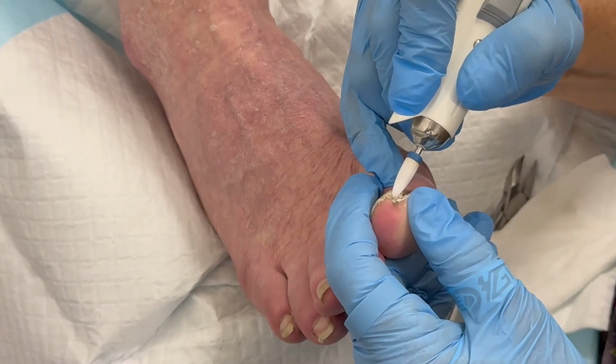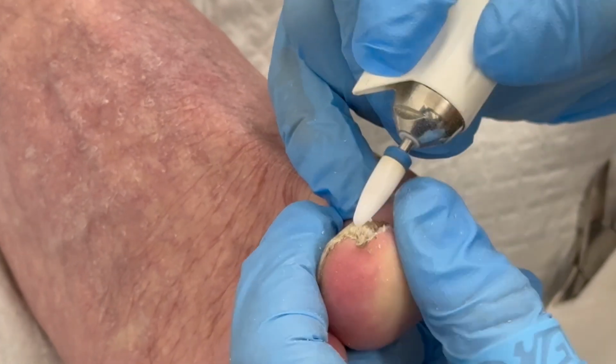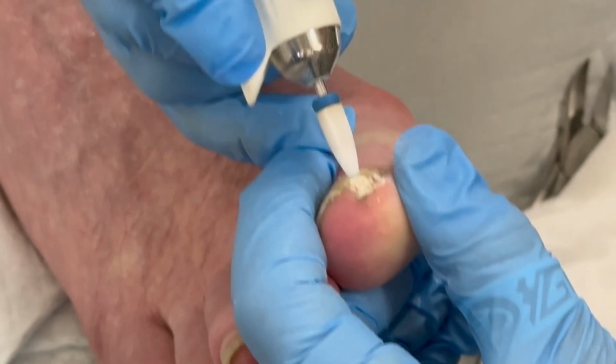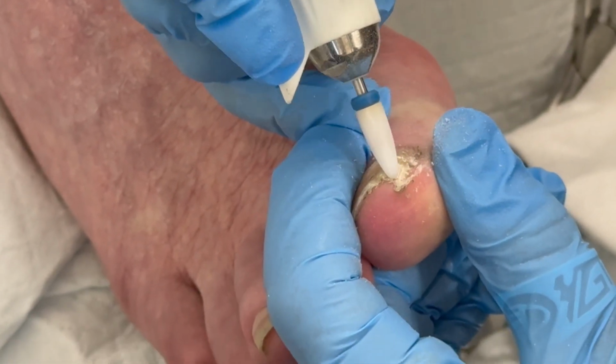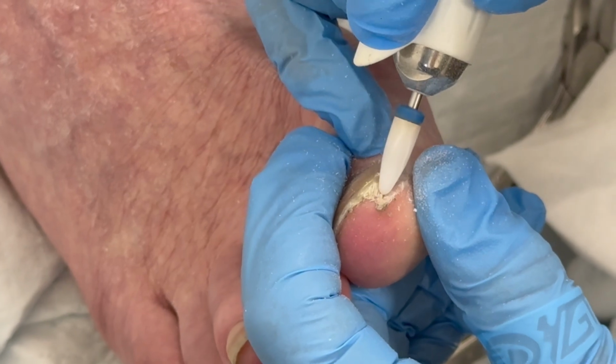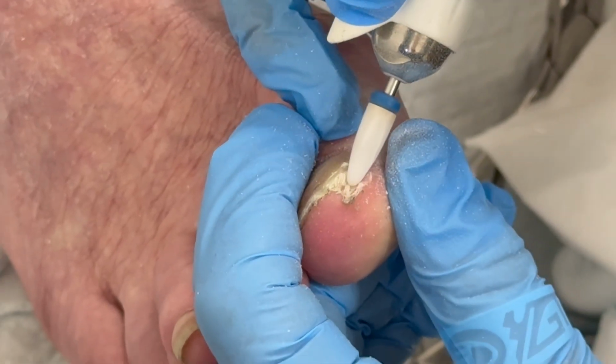This saves me. Usually I wear a mask, but I just can't talk and wear a mask and be comfortable at the same time. So this drill will get this nail thin and short.